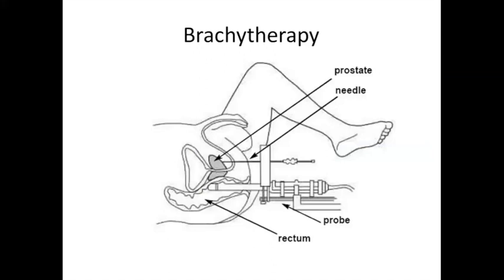So on to brachytherapy. Let's talk through the procedure of what we do and show you some graphic images that'll make your eyes water at 7 o'clock in the evening. Hopefully you've got your gin and tonic at the ready.